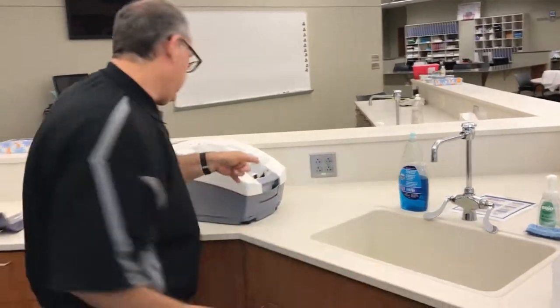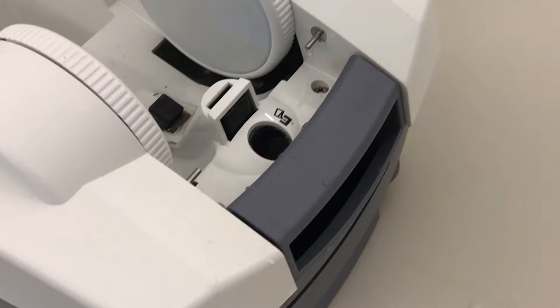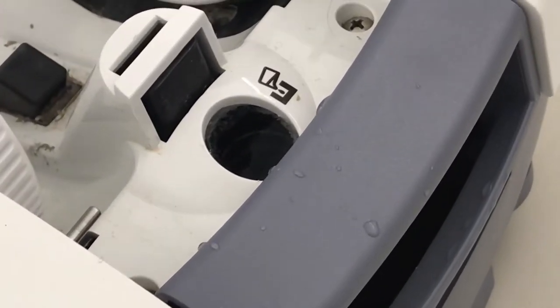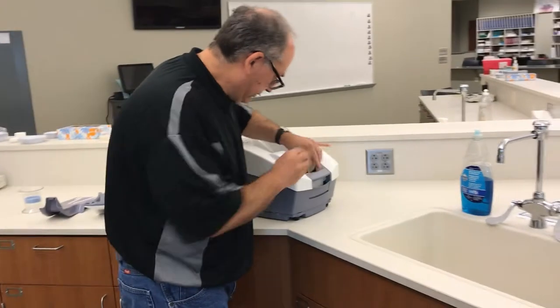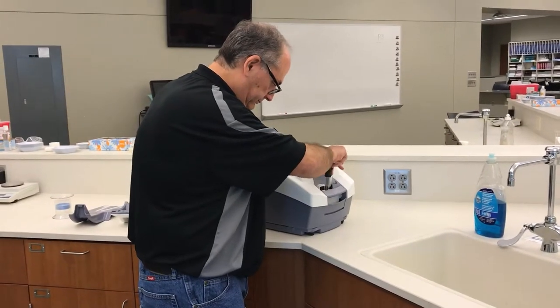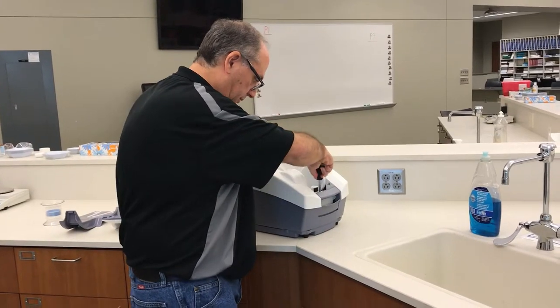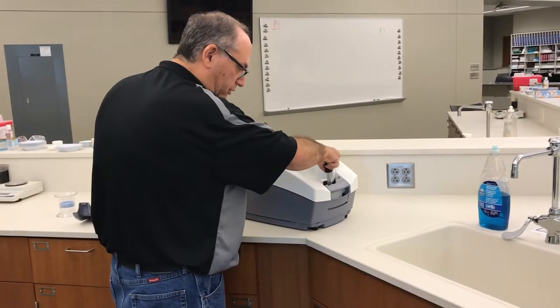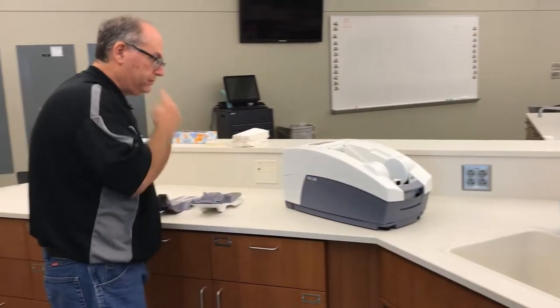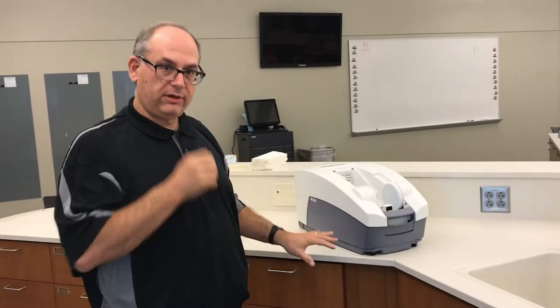Now you can see the water is all the way to the very top. I'm going to take the screw and put it back in, then tighten it up. You want to make sure it's tight but don't over-tighten or you could damage those threads. That's really all the maintenance required as far as getting water in and out of the device.